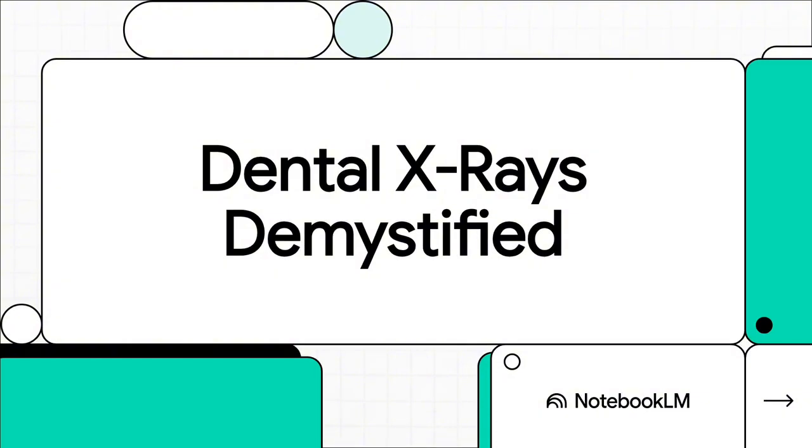Hey everyone, and welcome. Today, we're going to talk about something that's a super important part of any dental checkup, the X-ray. It's this amazing tool that lets your dental team see everything that's happening below the surface. But let's be real. For a lot of people, it can also be a source of some serious stress. So, okay, let's dive into this and figure out how we can make it a way better experience for everybody.